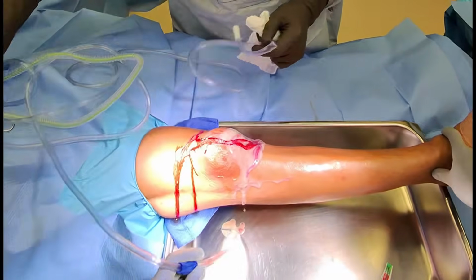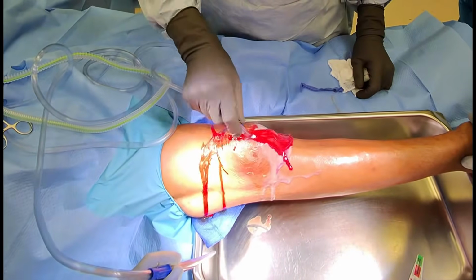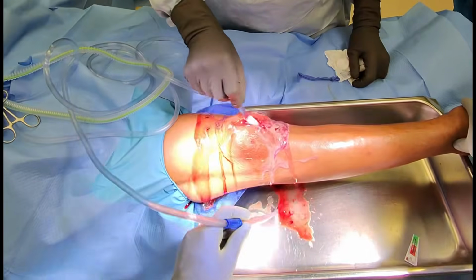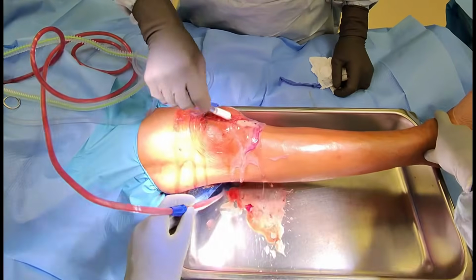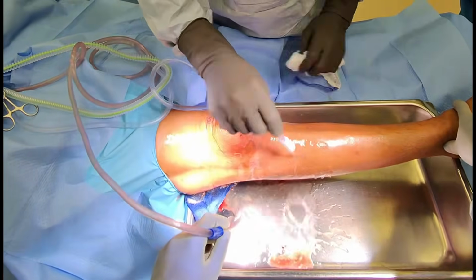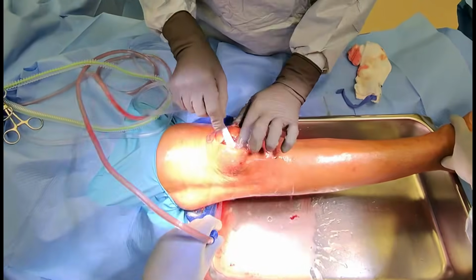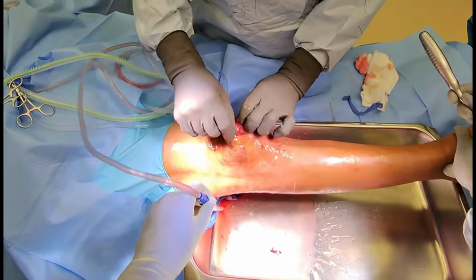Next, we wash the wound with sterile saline and debride the inner tissues to remove any further contaminants. An infection like this often forms loculations, or small walled-off chambers, inside the greater wound cavity. Using tools like curettes and rongeurs to debride the tissues helps to remove these loculations and more thoroughly clean the site.